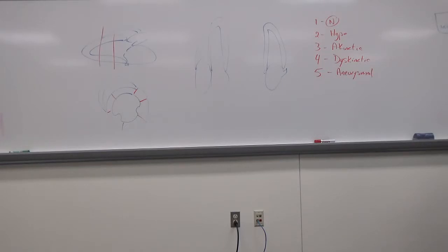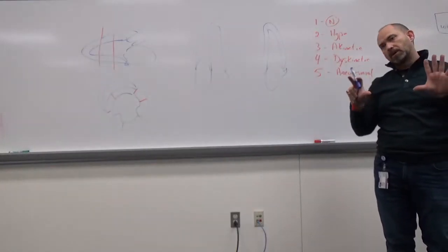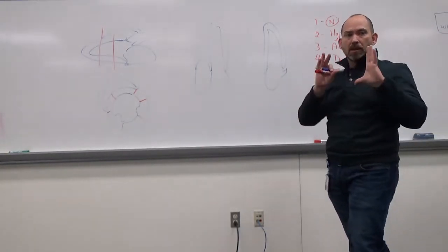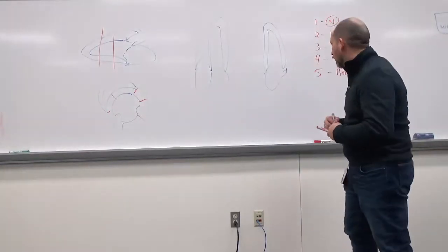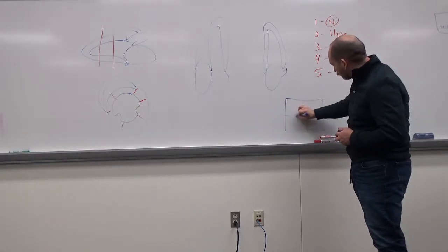So typically we'll take a resting set of echo images first, and as we've shown, I did kind of a display at the end of that Panopto from the ASE stuff because I couldn't find my disc from Feigenbaum, but it was just showing different wall segments. So on a standard stress echo representation, we do a 4-image split on your screen.